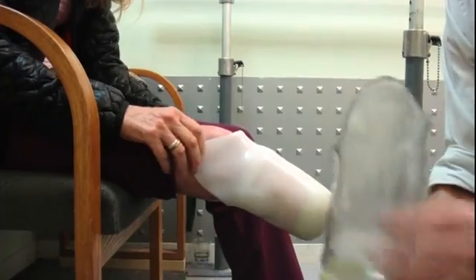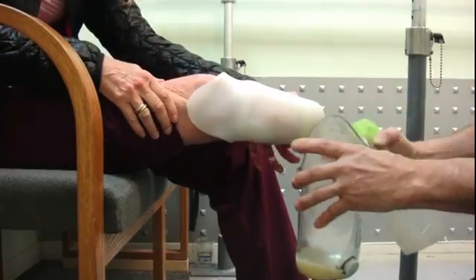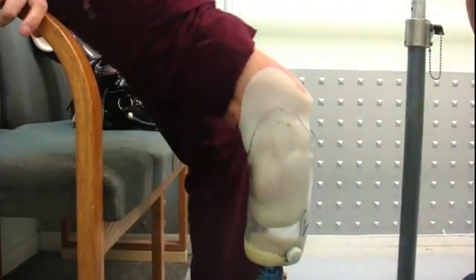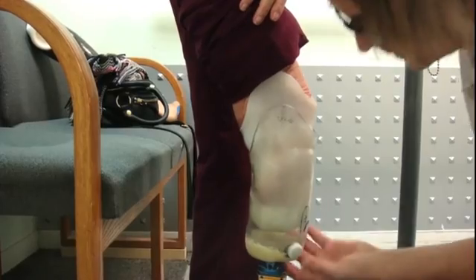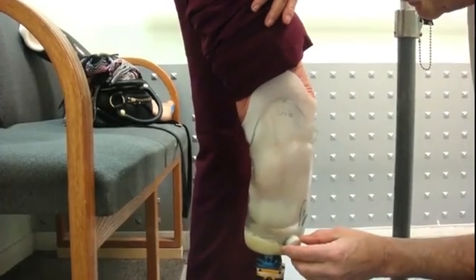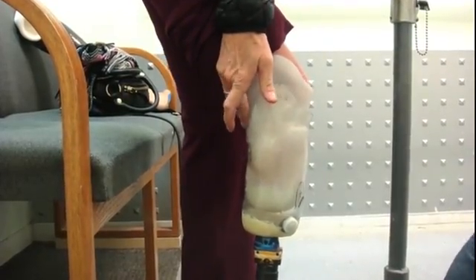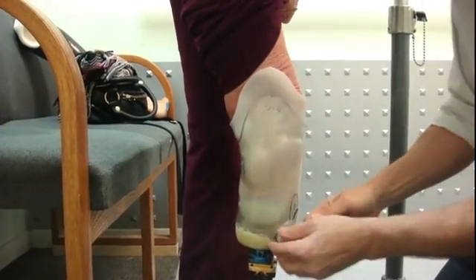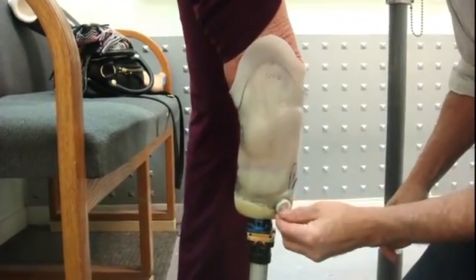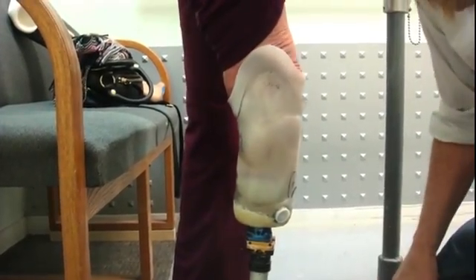Go ahead and stand up and press into that. It's fine, don't worry about it — that's the way it's meant to be. I don't hear the air coming out of the valve though. Are you pressing down? Let me pop the cap out. There's air coming out of the valve right now. Keep it going. There goes the Jesus spring — something just popped out.